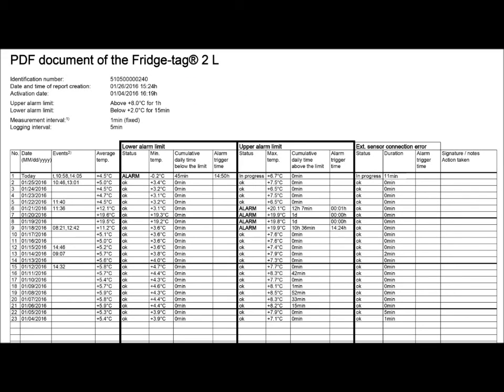It also shows the alarm settings and that the logging interval is every five minutes on a Fridgetag 2L.